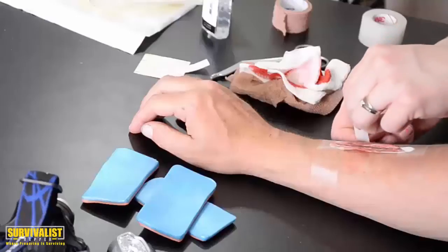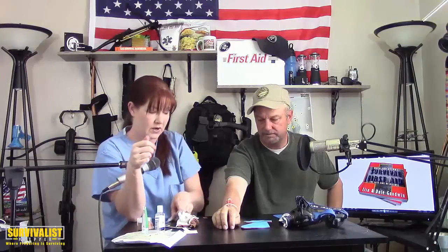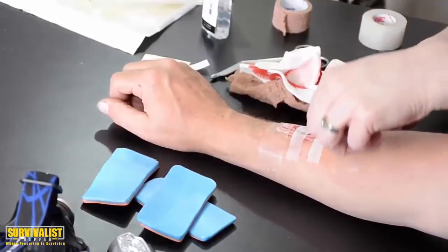I typically cut the steri-strip in half because I don't need four inches — with a smaller area, the tension is better with smaller pieces. Peel it off, put it on one side of the wound, and pull to the other side — you're basically pulling the skin closed. Put the next one on the opposite side and pull the other way, creating a zigzag of tension that pulls the skin taut together. Steri-strips can act like sutures because they have little strings in them that give added strength.